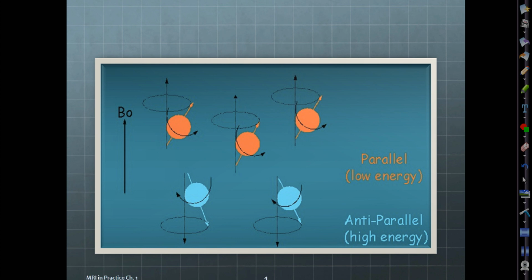So this is just another diagram because this is a good introduction to what we're going to talk about today, because we've talked about this net spin. So this spin right here is what we've discussed so far. And that comes from the 1 proton in the nucleus, but 0 neutrons. So if there's no neutron to counteract that proton spin, you get net spin. Or they sometimes call it angular momentum, right? So we have net spin.